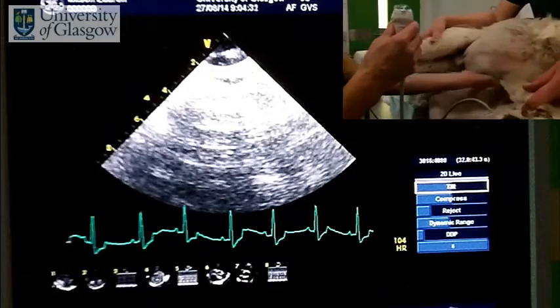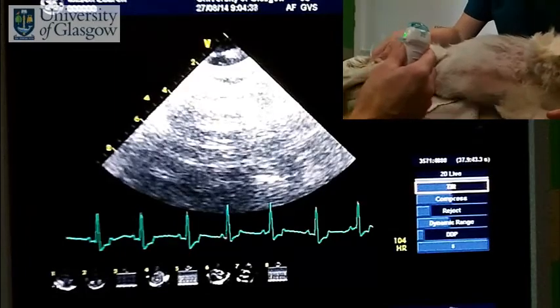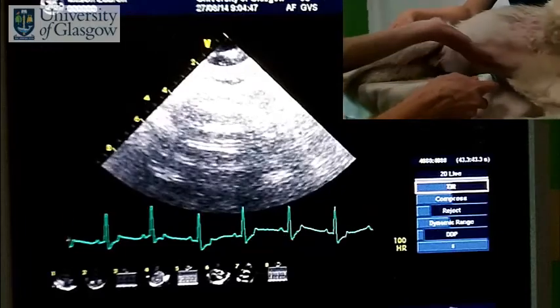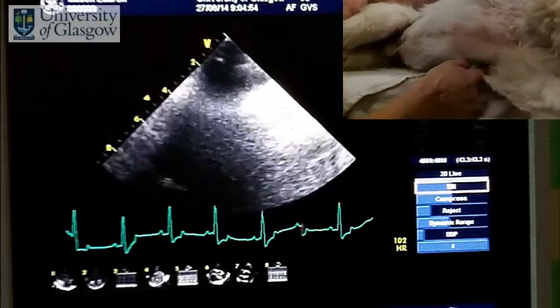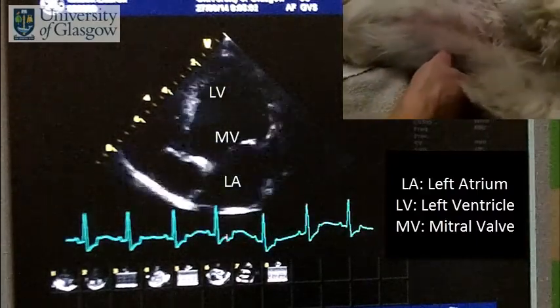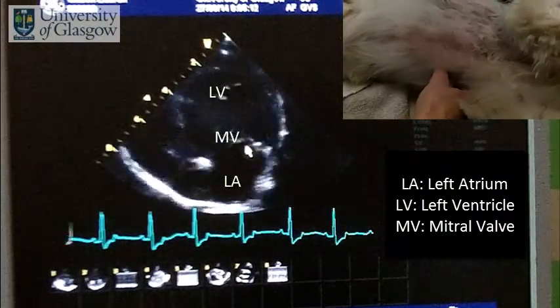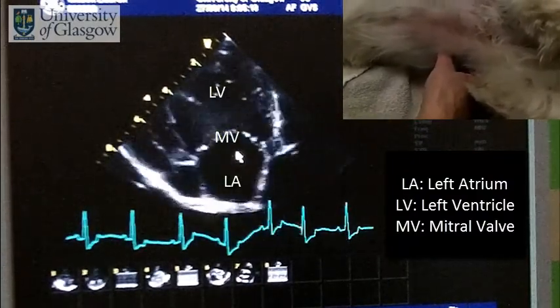Now we're going to look from the left side of the heart, again identifying the left apical beat. This time with the probe, rather than starting perpendicular, we're going to start with the probe much more angled, almost parallel with the dog, onto the apical beat. We're basically looking up the heart from the ventricles, and at the moment we're over the mitral valve, primarily looking at the left side of the left ventricle, left atrium, and the mitral valve.